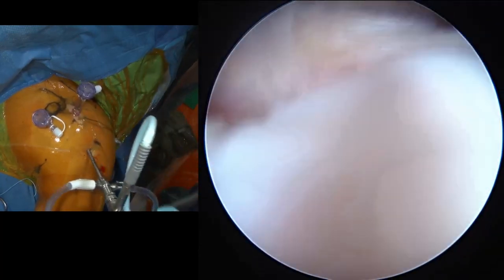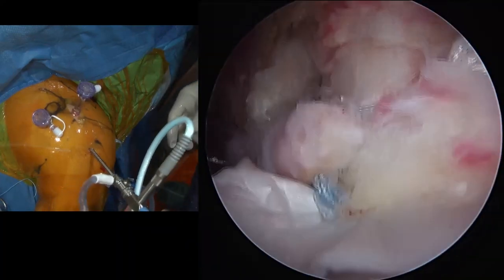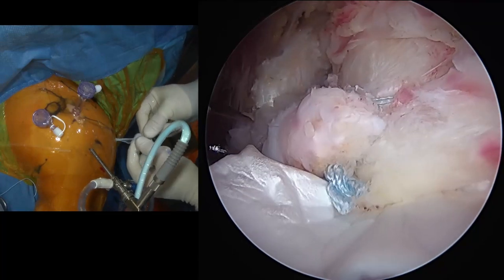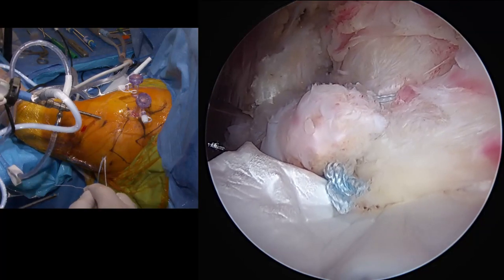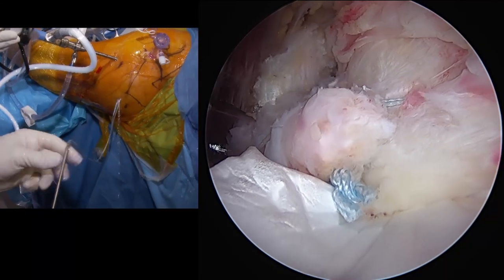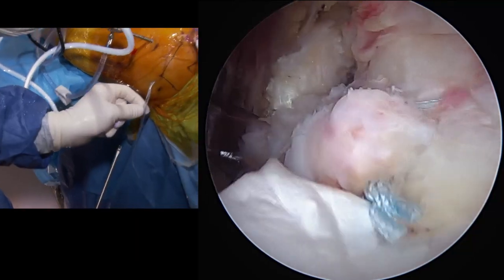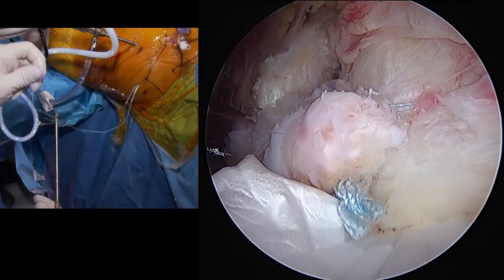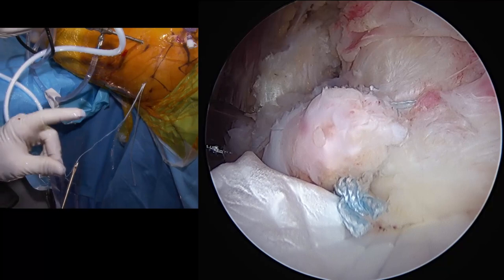All right, good. Take that back. Hold the scope, please. Let's have that open-ended cutter. So these fiber tapes were one, and we're going to cut the end of the swedge so that there'll be two, so that we can then do a diagonal over the top and a final speed bridge. So we'll cut those off. So now we have two white tails, and we'll do the same for the blue, and then we'll separate them out inside so that they go in the proper alignment.